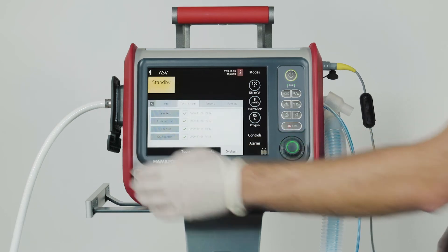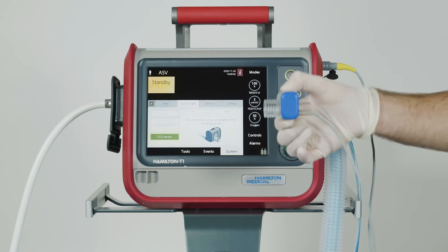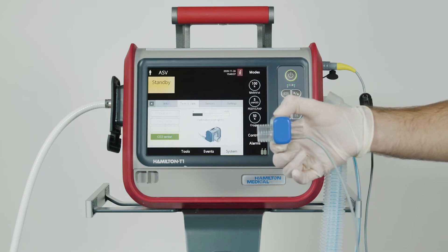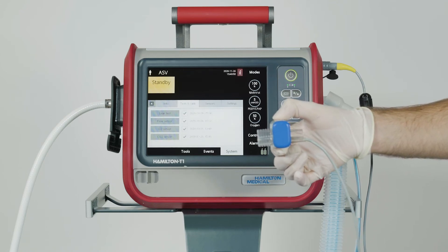It's important not to move the CO2 sensor during zero calibration. When zero calibration is complete, you should see a green check mark in the CO2 sensor checkbox.